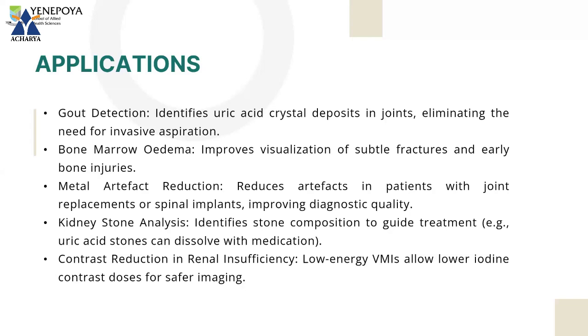Next, in case of kidney stone, as I told you, it will be helpful and useful in identifying the composition of the stone to guide the treatment. So there are different types of stones. You get to know what kind of renal calculi is present in the particular patient.